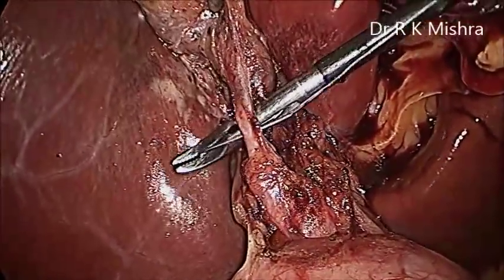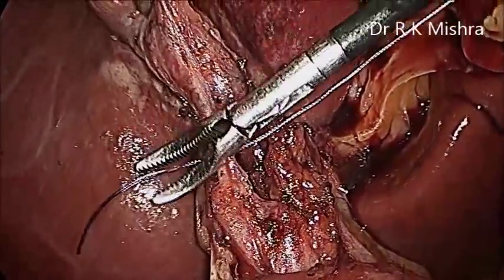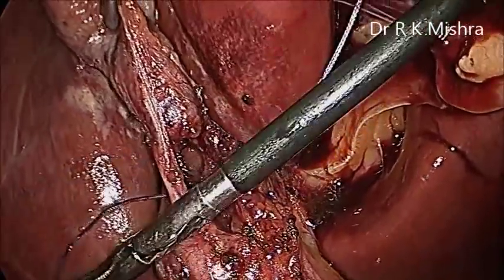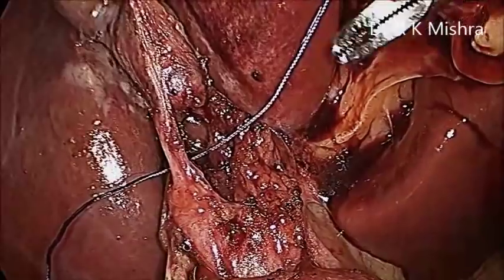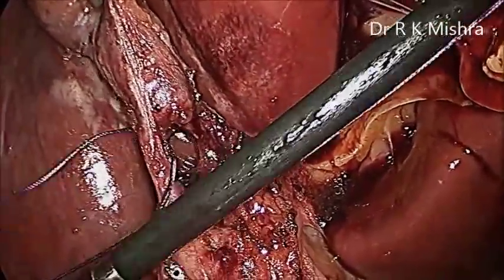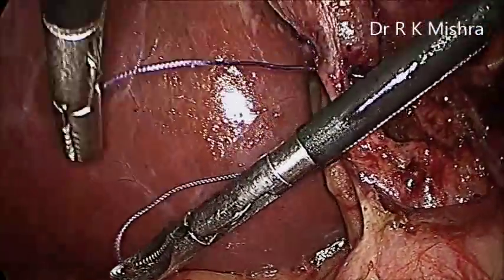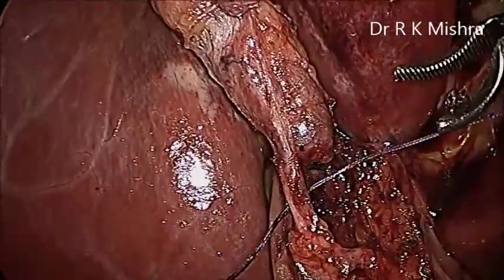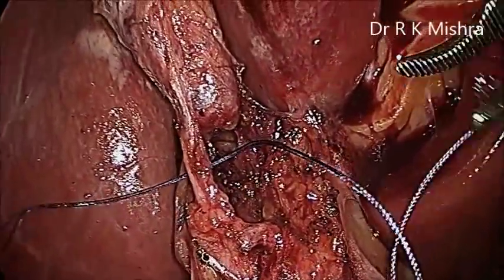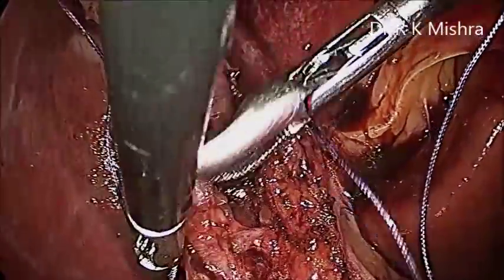Now this is the vicryl which is coming, and you can feed it, and then it has to be taken to the other side. Even when we perform the single port cholecystectomy, at that time also using the vicryl is a good idea. And tying the knot is always better. And in my opinion, for any tubular structure like cystic duct, cystic artery, renal artery, splenic artery, extracorporeal knots are much better than the intracorporeal. And here it is taken.